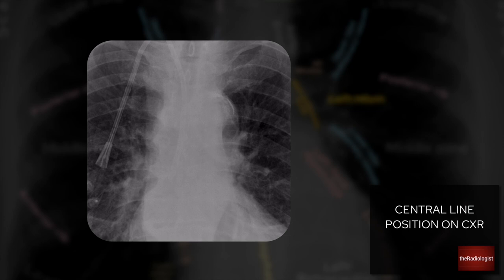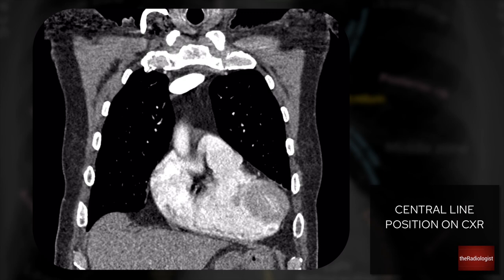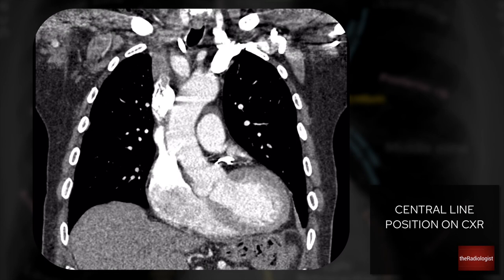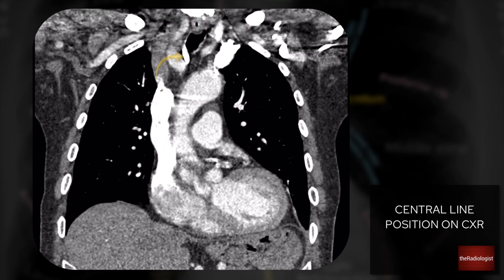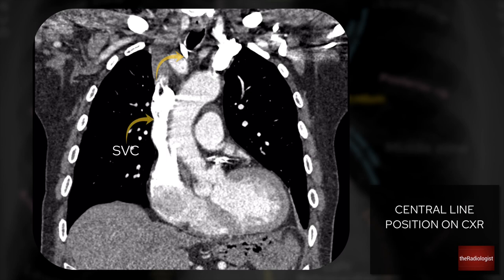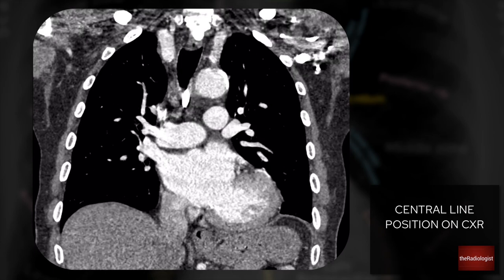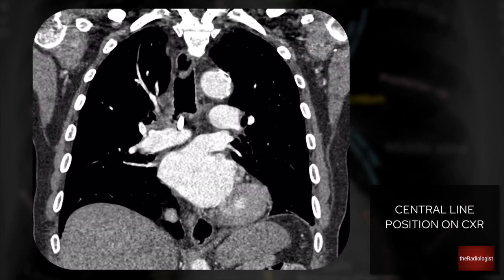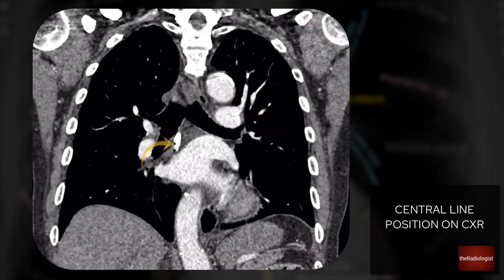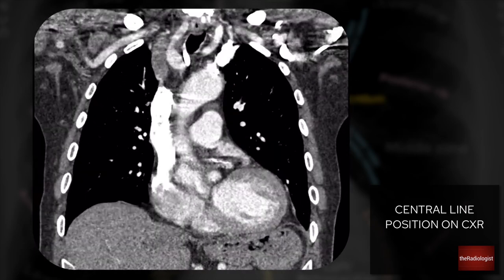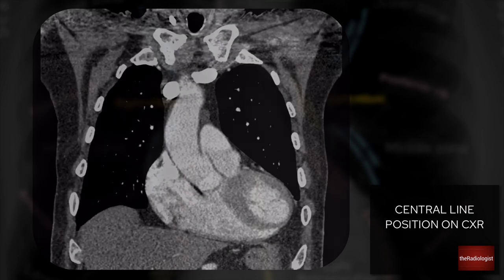We actually have a CT scan to confirm where this line was. On this coronal CT view, we can see the line entering the neck. Following it through, it never really enters a vessel and heads medially. The SVC is over here, but the line goes nowhere near it and heads towards the mediastinal fat in the centre of the chest, ending up just above the left atrium. This is an abnormal position — the line needs to be removed and repositioned.